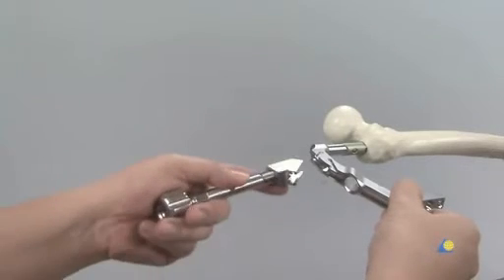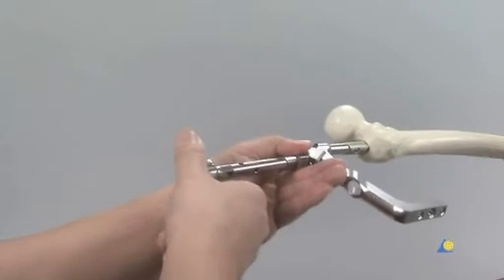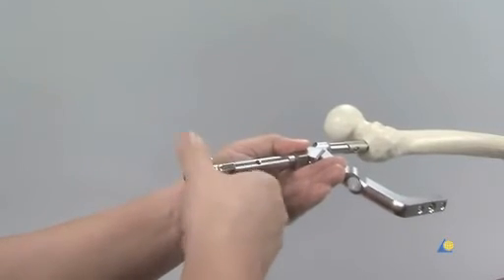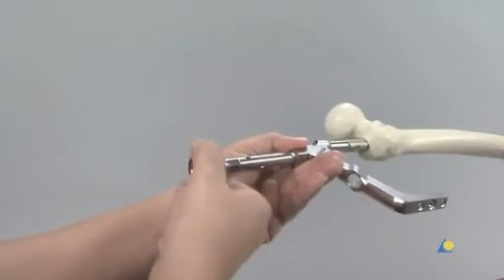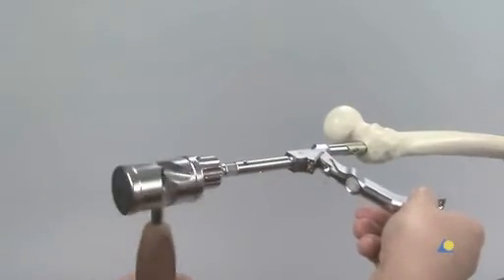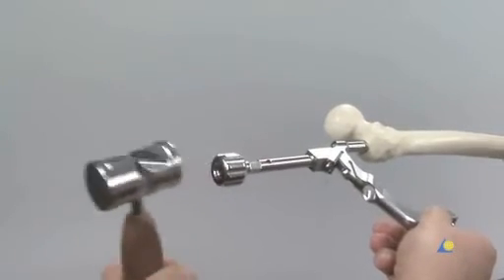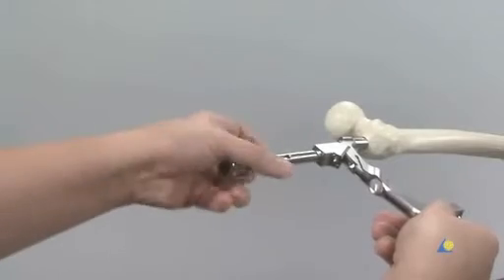If insertion cannot be completed manually, the connector is attached to the insertion handle. The slot nearest the nail should be used so that the connector lies parallel to the nail for easier insertion, transmitting force more in line with the nail. The nail is advanced with gentle blows of the hammer. The insertion handle itself must never be struck directly. The connector is then removed.